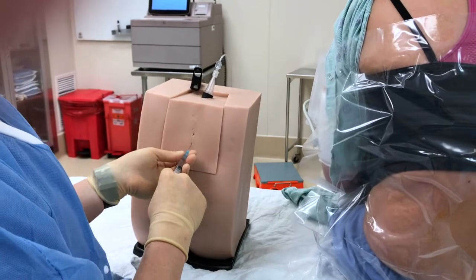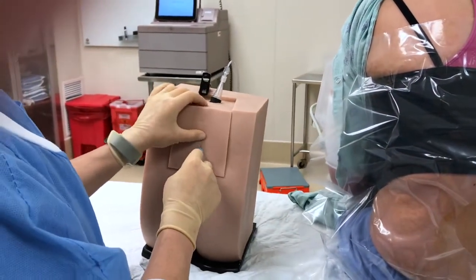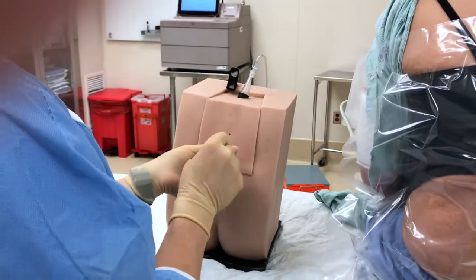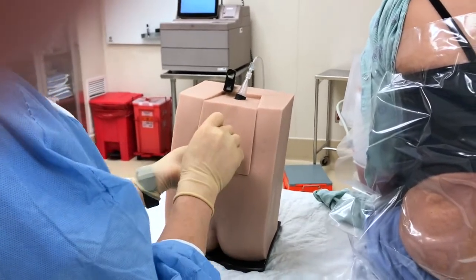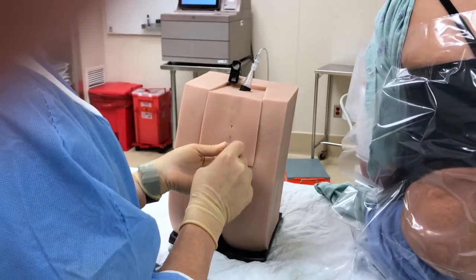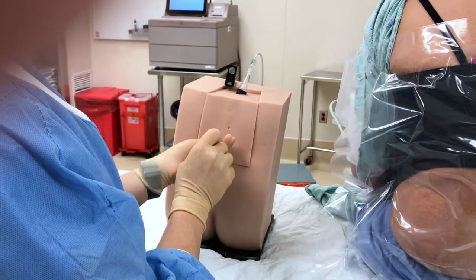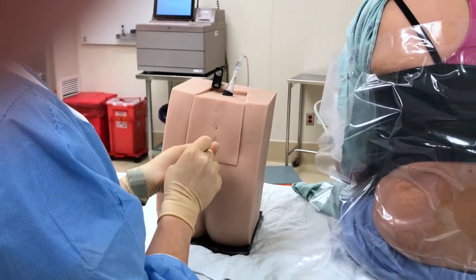Some people like to do different angulations that helps them feel, if for some reason the spinous process was not easily palpable, some people actually like to use this as a finder needle to kind of angle in different directions, and you get a good sense of the ligaments as well as any processes that you might encounter if you were not able to palpate them easily.